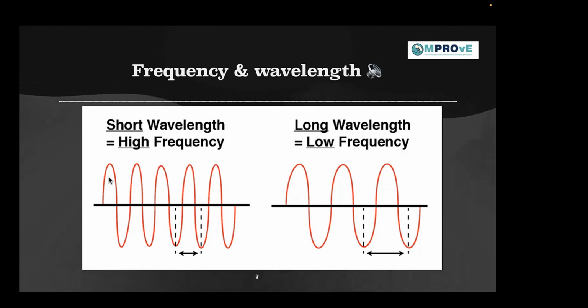So how does it impact us in a clinical scenario? If you have high frequency waves, then you get a very crisp image. You get an ultra high definition sort of image, but at the loss of penetration. So you can use a high frequency probe to visualize any organ or structure which is very superficial, because it will give you a very crisp image, but it can only visualize the superficial organs.